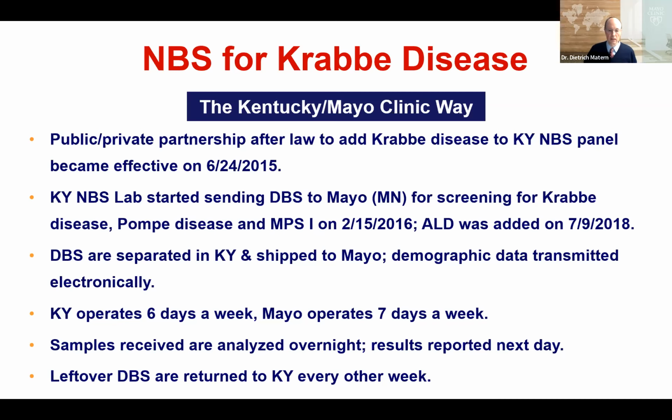And we also then added Pompe disease and screening for MPS I at the same time, and a couple of years later for adrenoleukodystrophy. So that started in reality in February. So basically, what is it, 7 years now almost, that we screen babies in Kentucky, and added adrenoleukodystrophy in July of 2018. Samples are arriving first in the Kentucky Screening Lab from the birthplaces in Kentucky, and then overnight get to us, and then we do the analysis.